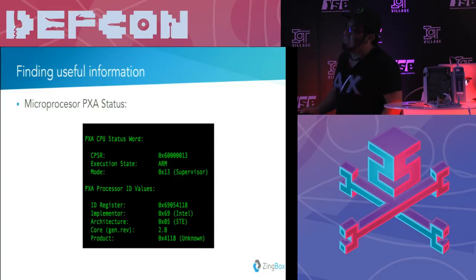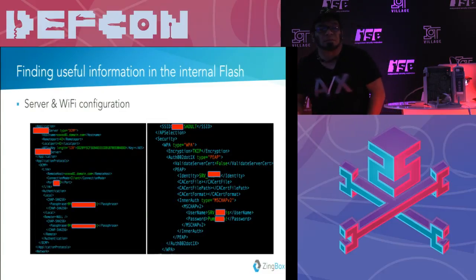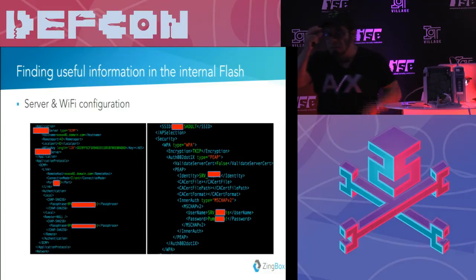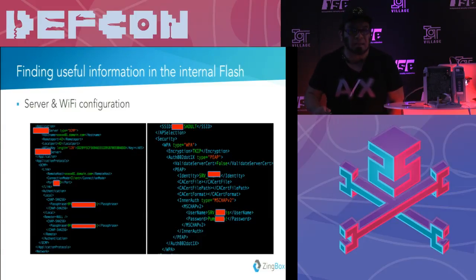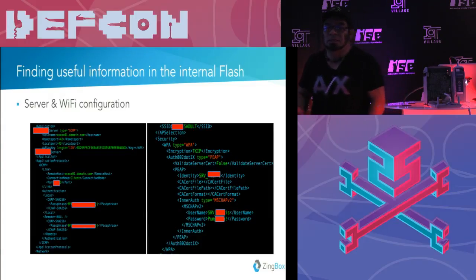We confirm that it is an ARM system. It is in supervisor mode. It is the Intel manufacturer, even though now it's Marvell, and the version. And here is the most important thing, guys. We found a way to read the flash without using any chip-related tools. That's very important because it's easier.